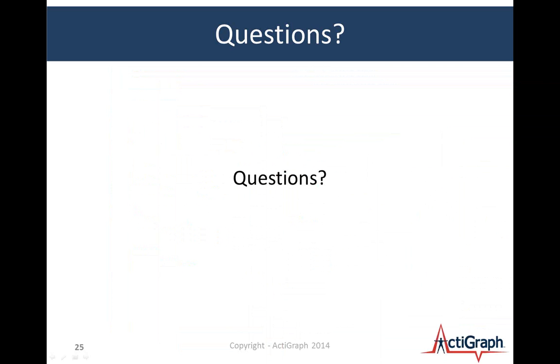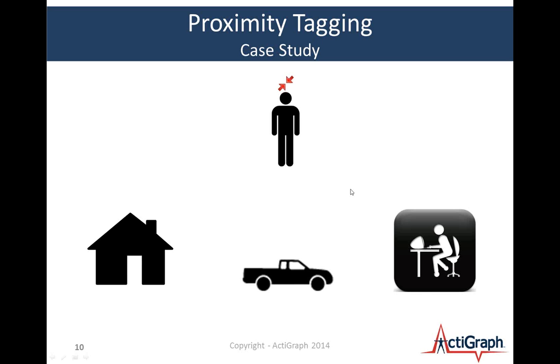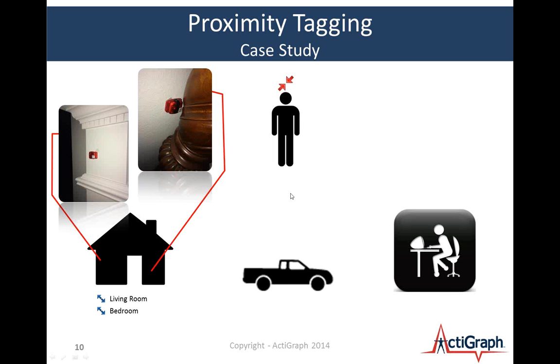The orientation up, down, left, right doesn't matter so much, but you'll notice in our earlier slide, and I'll pull that up here, that these devices were mounted facing outward on the wall. That's a pretty good layout because that prevents the backside of the device from blocking the signal. And so rather than laying them flat on a table, this is a little bit better option here. But it also depends on what resolution you hope to get and other factors. But I hope that helps answer your question.